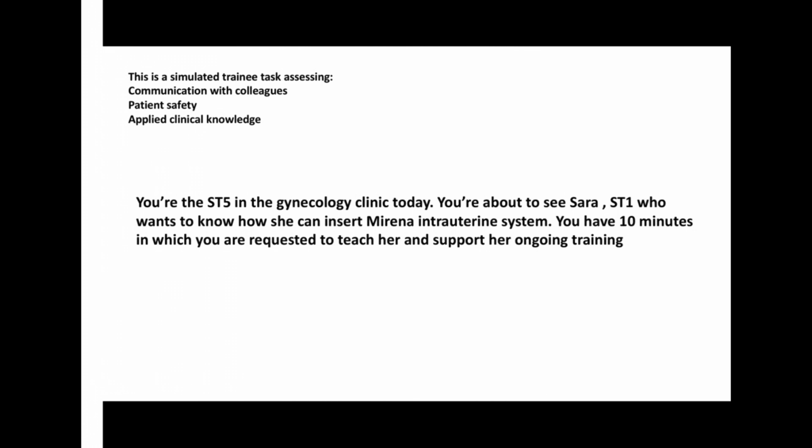There is a risk of spontaneous expulsion with any coil, so we need to tell the patient sometimes you may expel the coil without any reason. There is a risk of failure because no contraceptive method is 100% effective. So there is a very minimal risk of failure, and if it fails and pregnancy happens, most probably this pregnancy will be an ectopic one. So we need to notify the patient about this issue. That's for the coil itself.